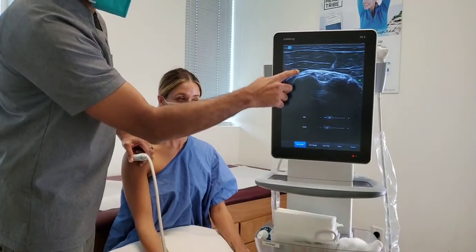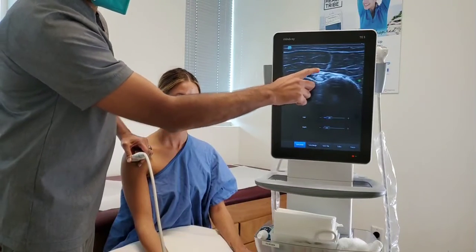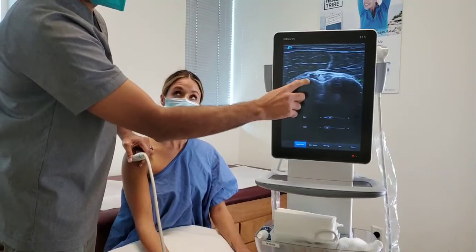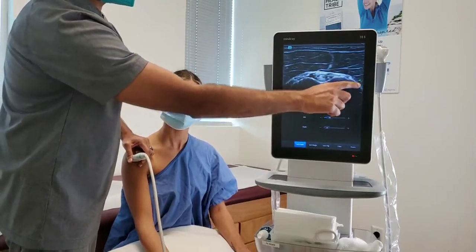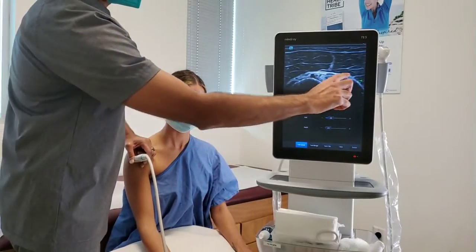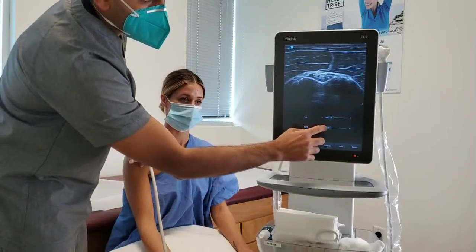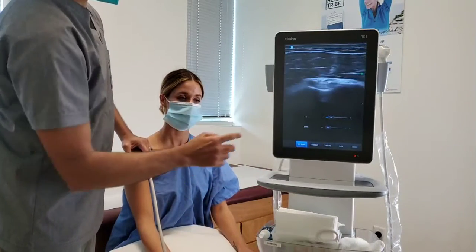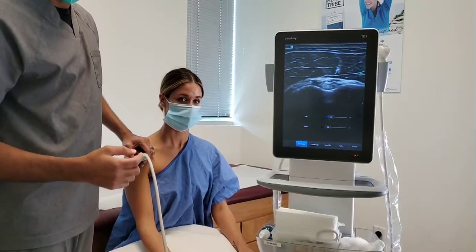Other structures like muscle that we see here are darker. Other structures like ligaments and tendons could be darker than the muscle, but brighter than the muscle, but not as bright as the bone underneath. So what we're looking at here is the bone, or the arm bone there, and we're looking at the biceps tendon. So this round structure right here is the biceps tendon in cross section.